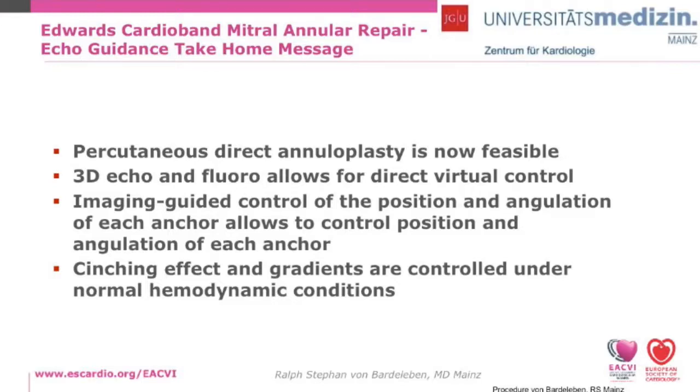Total leaflet detachment or embolization is, compared to LAA closure, an extremely rare situation, with less than 0.1 per mille of the procedures. So very, very rare, almost none. The second thing, complications of the TOE during the procedure, is also extremely rare.